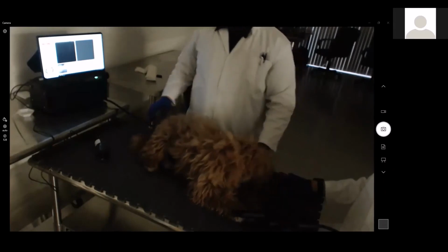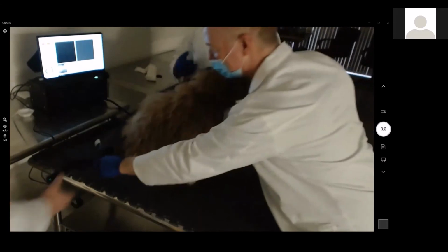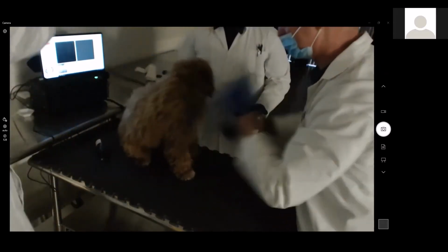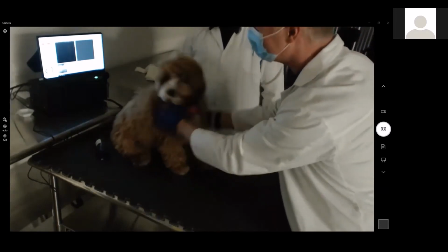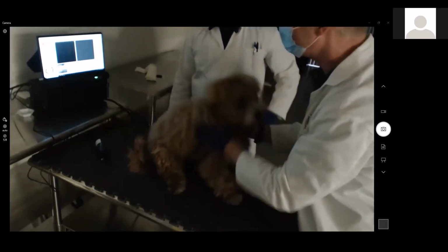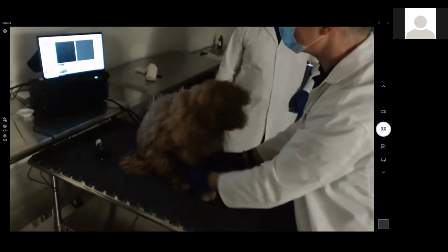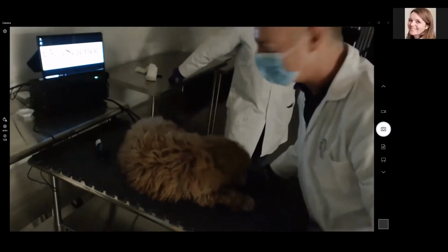I apologize. I'm not successful in showing you how to get the retina and the cornea. That's not what I wanted to do. But sometimes we're just going to have to drop back and punt. The only thing else I can show is we could do a quick fundus on him. And I got a toy that I'm trying out, just kind of curious about it. But it's a fundus camera, like other ones that are available.